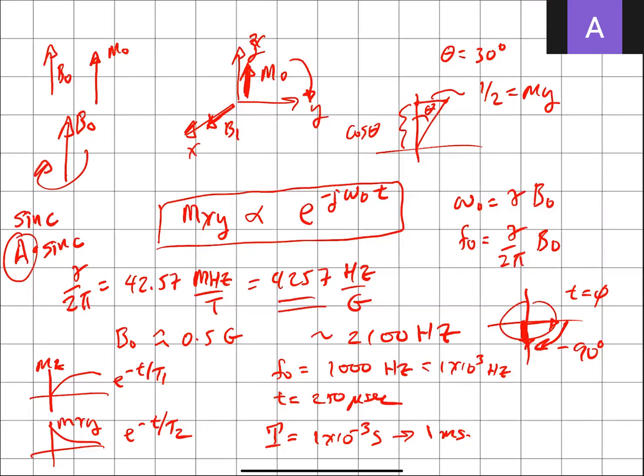Okay, and then a quick other question about the left-hand rule versus the right-hand rule. I've always used the right-hand rule, but is that because we were using conventional current, pretending they were positive charge flows, but now it's actually positive flow, so we use left to be consistent? That's basically due to the gyromagnetic ratio.